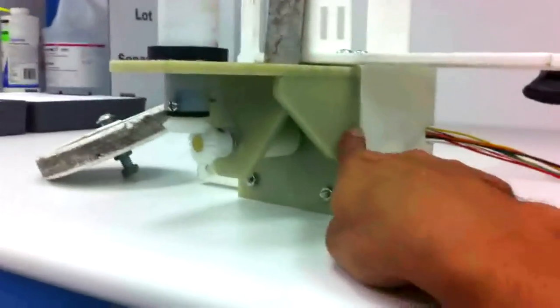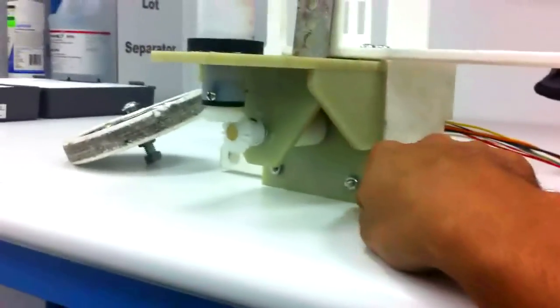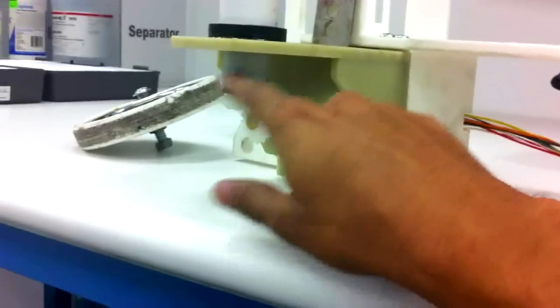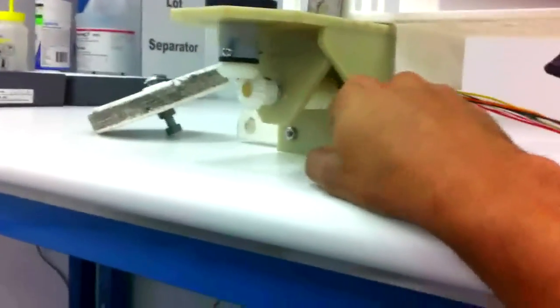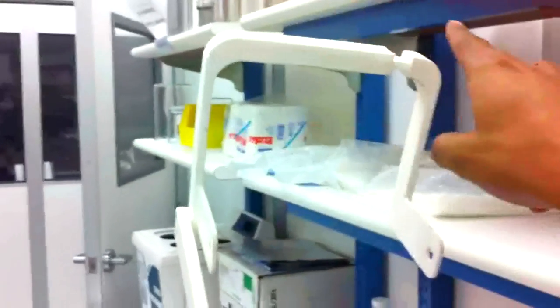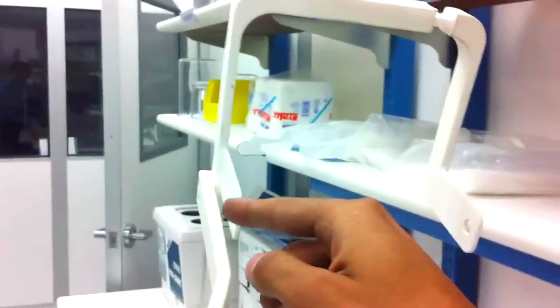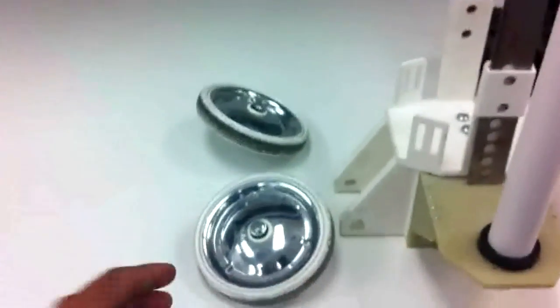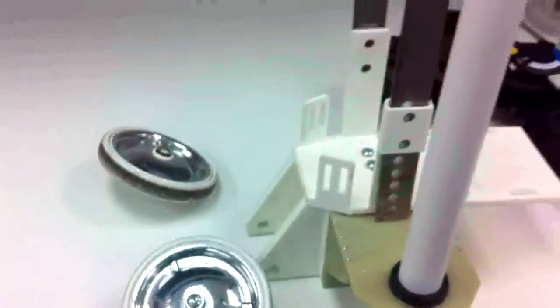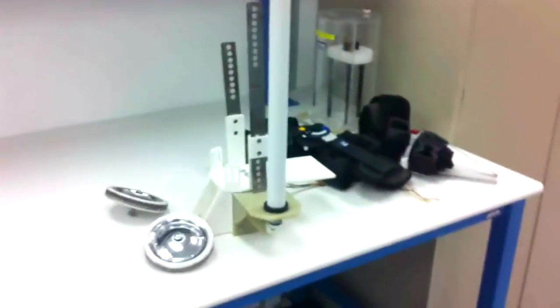And over here we have the motor and we have the bracket that the motor drives these gears within this bracket, and these are basically bushings to support your gears. And we go up the drive shaft, more gears coupled here, and we have this mount which inserts into the top of the knee brace. Also, we have these wheels which attach in the back right here, just like that. And that is our design.